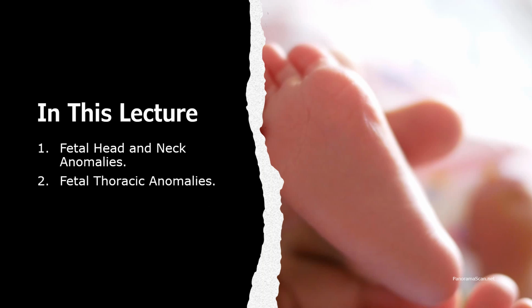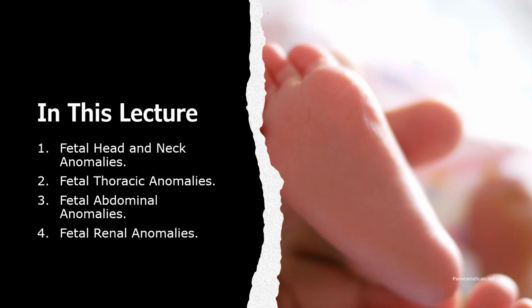Fetal thoracic anomalies such as congenital diaphragmatic hernia and lung malformations. Fetal abdominal anomalies including defects like Omphalocele or Gastroschisis. Fetal renal anomalies such as kidney malformations and urinary tract obstructions. Fetal spinal abnormalities focusing on conditions like spina bifida and other neural tube defects and sacrococcygeal teratoma.